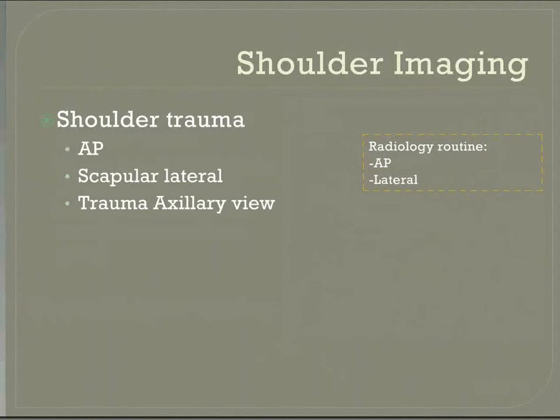Well, the problem is if you're going to get underneath, yes, you're actually going to get directly underneath there. You'll push it down the bed, but you also have to then get the arms a fair way away. So they've been our limiting factors. If there are other ways to do it, then that's fine. If our doctors want to come out to, do you have a mobile one? A mobile one. It's slightly smaller, yeah. But again, you're going to then come to the risk with the quality of the film. So the output is not going to be the same.